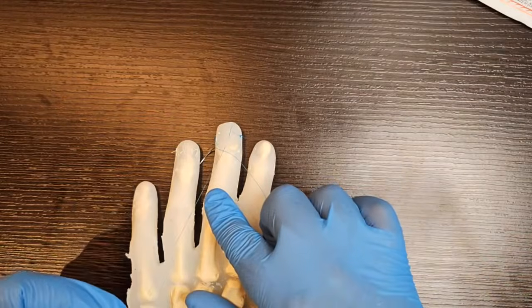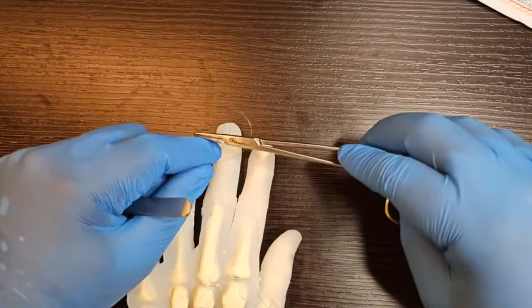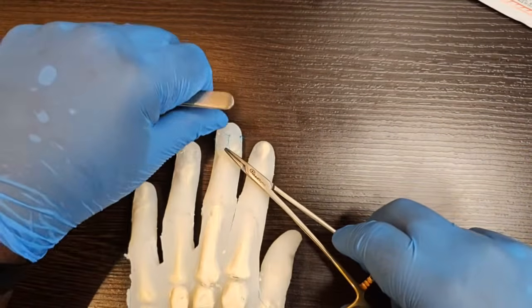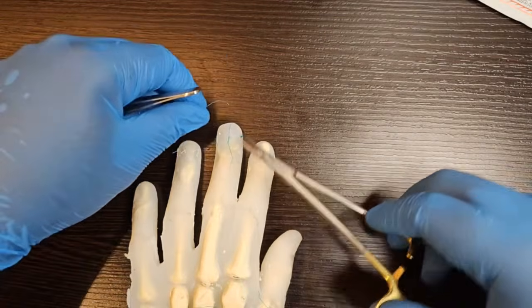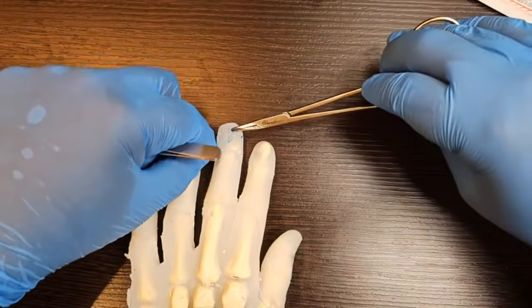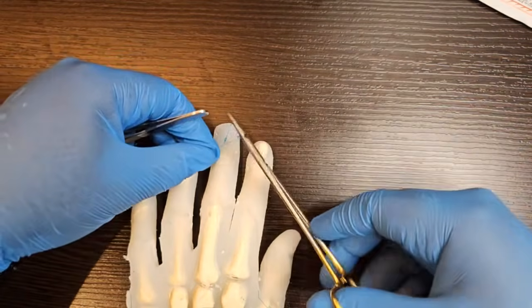and pull. And so when you're tying your knots, again, same thing applies. If you put a lot of force into it, you'll just rip it. So push, place, and rotate. Surgeon's knot, but lay it down, push it down, push down the knot. Not too much force, otherwise it will just rip. This is not a strength competition. Push, place, and rotate. And just watch your knot get secure. Don't pull it aggressively. The nail bed is friable after trauma.